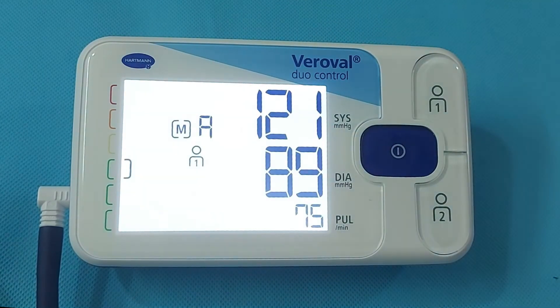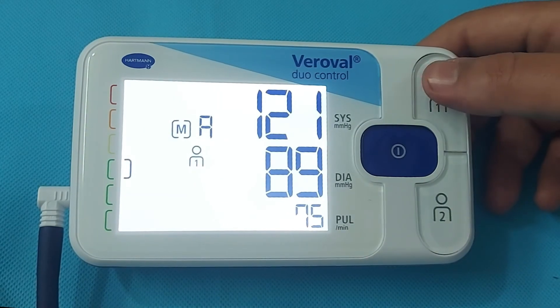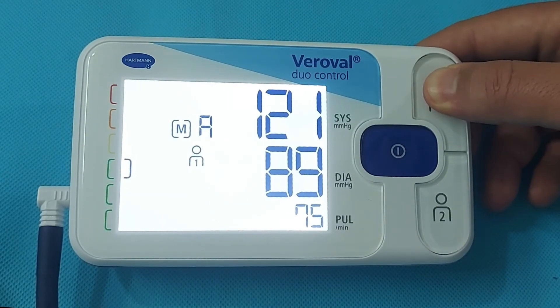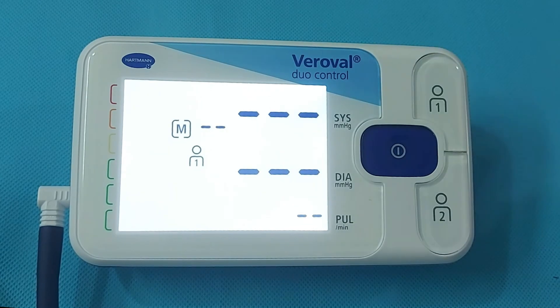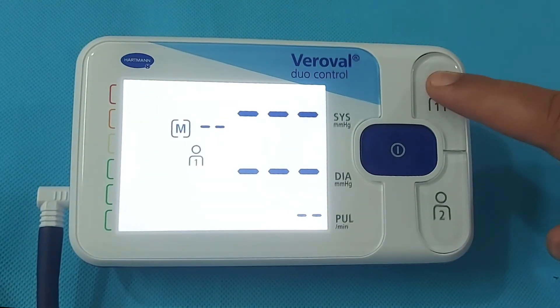If you want to delete all of the results from the monitor, press and hold the User button for 4 seconds, then press and hold for another 4 seconds. After that, the device will delete all the BP readings and you will get no data when you check it again.